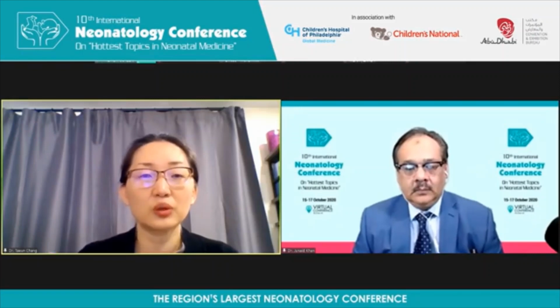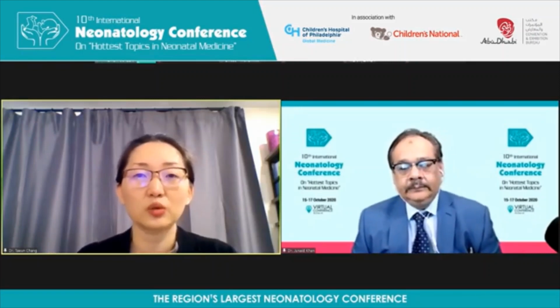You don't get a lot of those state features that you would get in a more mature brain. And so the EEG changes. When we train neurology fellows, when they're learning how to look at the EEG, I always say, try to guess the age of the patient just by the EEG. Don't look at the sheet of paper telling you what the gestational age is.